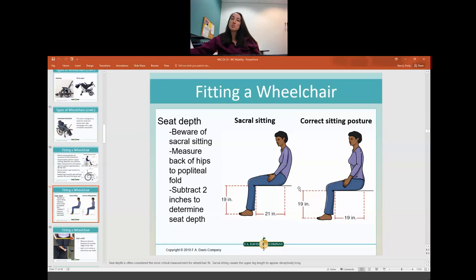This is an example of sacral sitting — a slouched posture. The problem is if you measure seat depth and other dimensions with them in a slouched position, it's going to be too long because you're actually measuring empty space plus their actual leg measurement. So you want to scoot them all the way back in the chair.